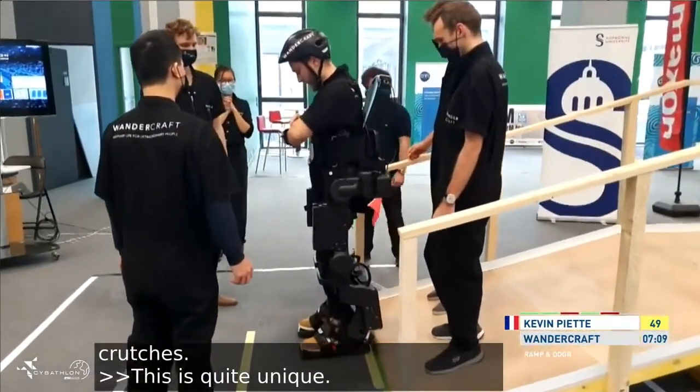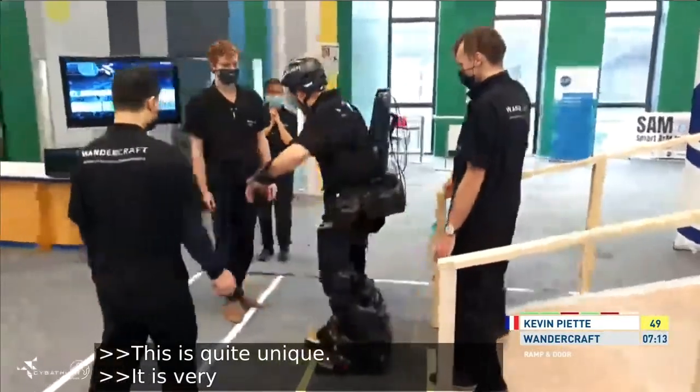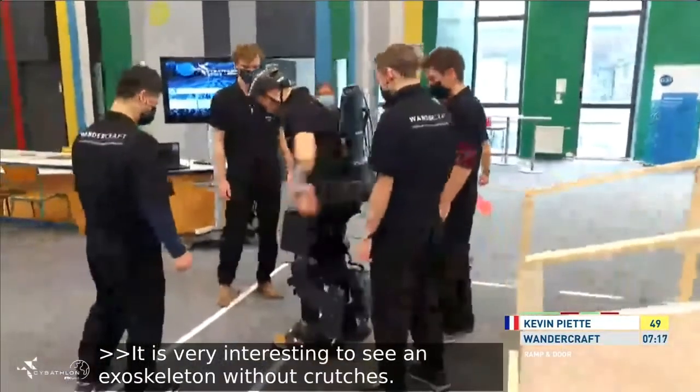Yes, it's very cool to see one of these exoskeletons without crutches, because one of the needs from a lot of these patients is to be able to have their hands free to interact with objects in daily life.